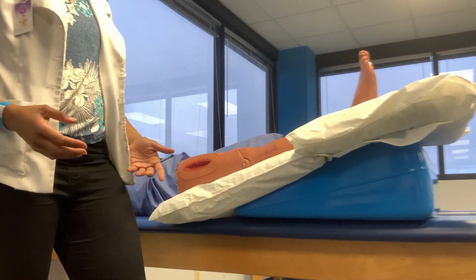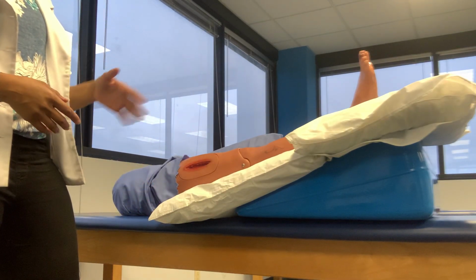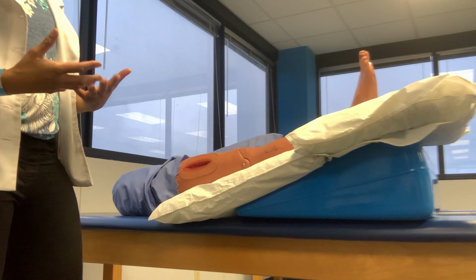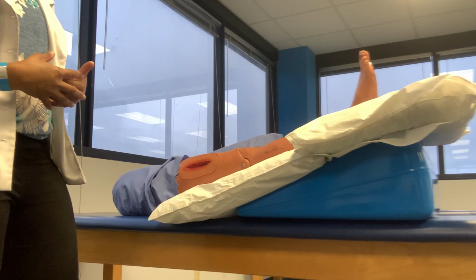That way you know what the quality of the skin is like at the start of the treatment, so that if anytime during the treatment you notice any changes, or at the end, then you'll know that there was an issue with either the amount of pressure or the stockinette, or something wasn't right.